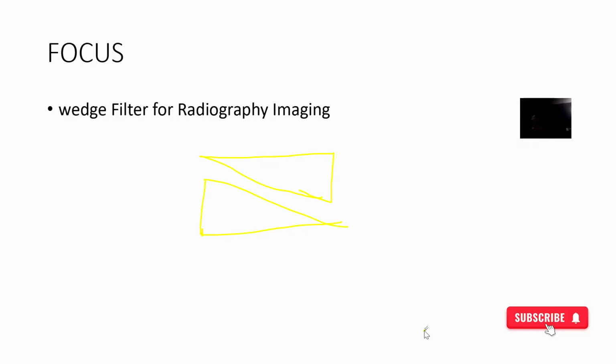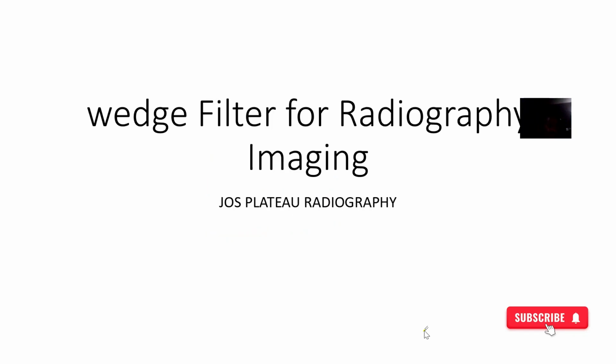Repeat exposure simply means I did an imaging for a patient, but it was not done right, so I'm still telling the patient to come back again for the imaging, which should not be nice. The patient might spend more and also be more uncomfortable.